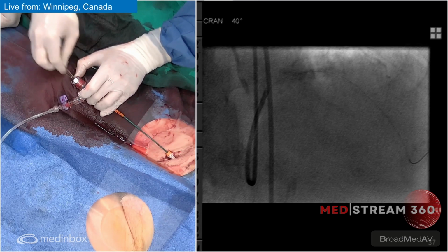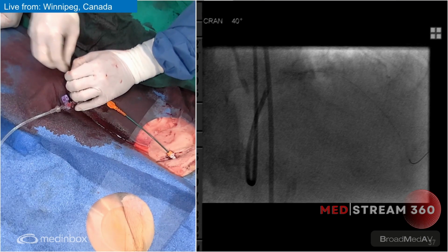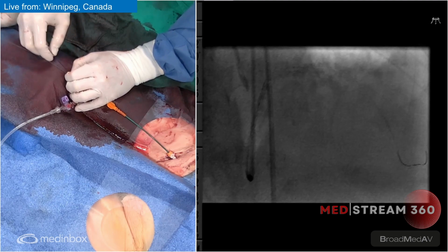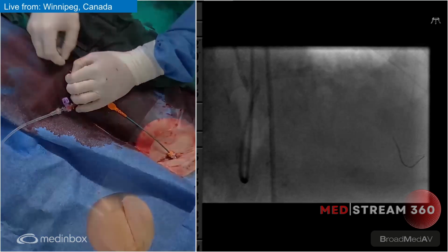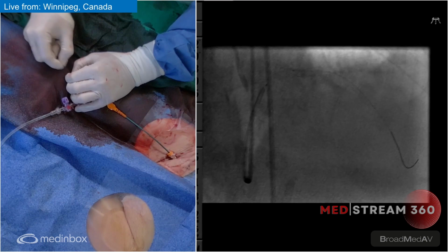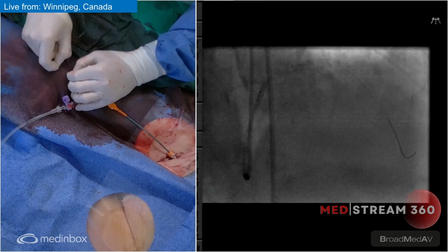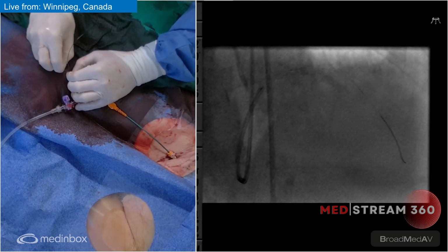You can look. I got it. There you go, Jim. Let's see. It does need that traction to straighten it up a little bit to bring the RX part down. As I do that, it does make a difference. Let's see. Now it's the part. Looks buckled. No, it doesn't. I think you're buckled in the aorta.